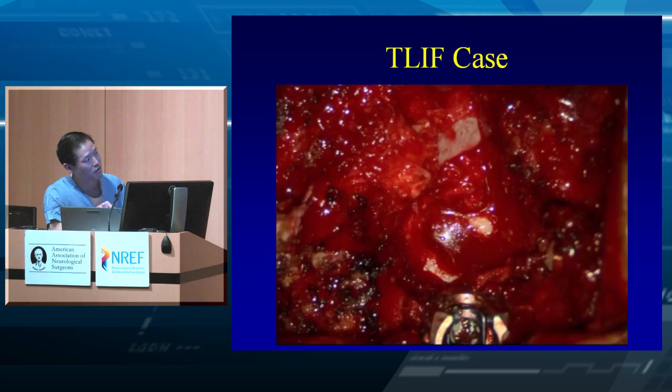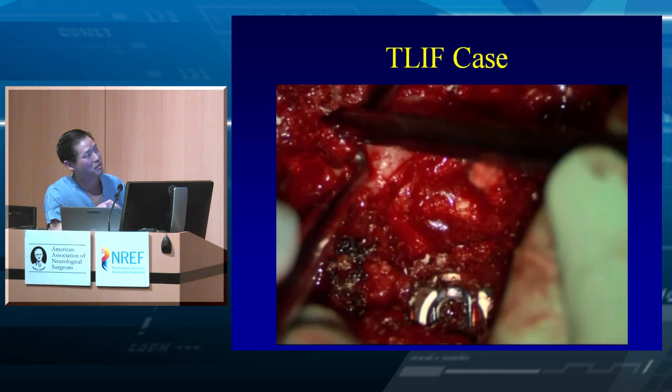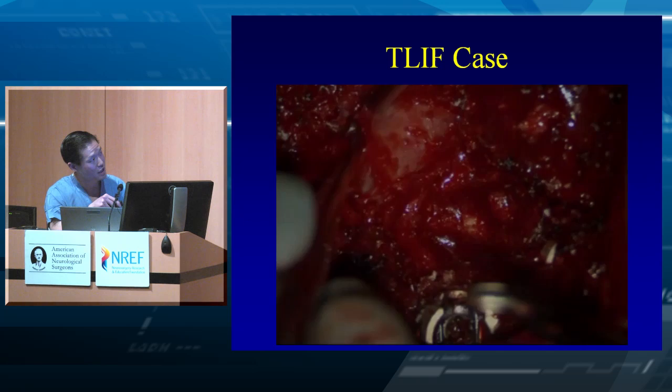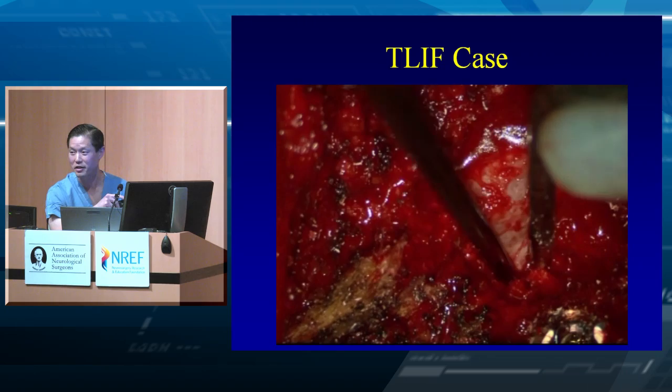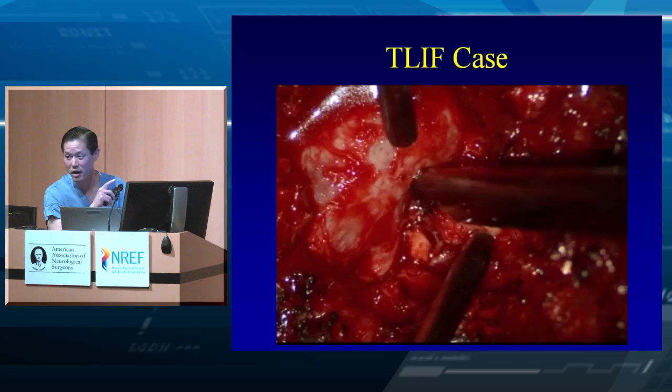Once you do that, this is just showing the laminectomy, and this is pretty standard here. I wish I could maybe advance this a little bit, but it's not too long of a video. So then we do a complete discectomy, and I think this is an important part of a TLIF, right? You shouldn't just put a rotate shaver in a couple times and impact your cage. How you do your discectomy is going to be very important in terms of outcomes. The better the discectomy you do, the better the end plate preparation, I think, is going to make a huge difference in terms of your outcome.